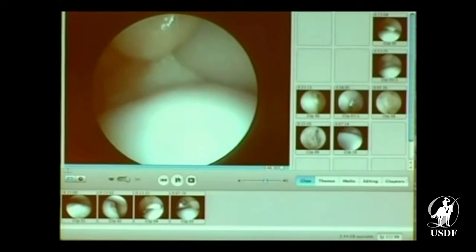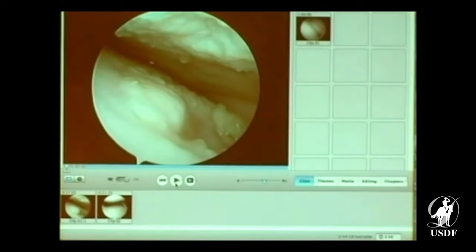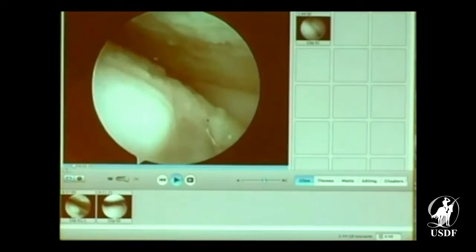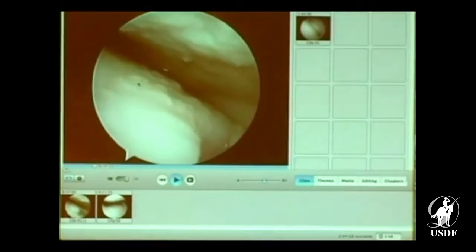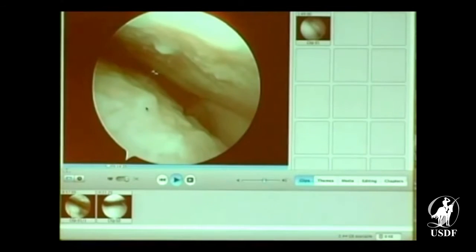So I do warmblood surgery. It tends to be exploratory stifle and fragments in horses that have been bred in the United States. But other than that, I don't do as much arthroscopy in the warmbloods. And let me just see if there were a couple of others. This is good to look at because you'll see the contrast here. This is an arthritic joint now. You can see that it's got the defect in the same area, but see how roughened the cartilage is, and the other joints were smooth and pristine. Look at all this tissue here. There it's normal, but over here it's all abnormal on the patella and the groove as it was rubbing across there. So that's not a very good thing to find in a dressage horse.